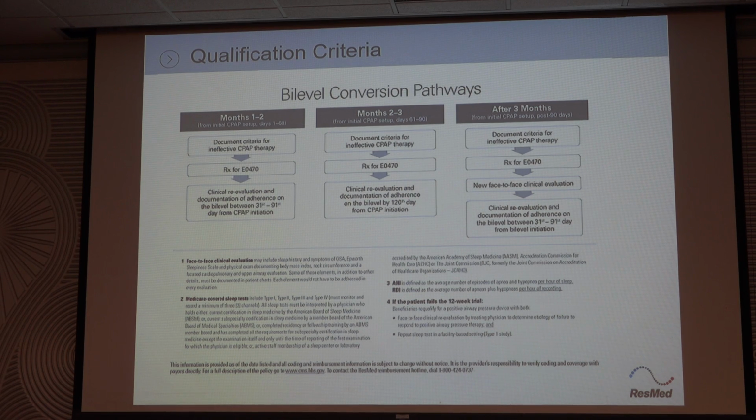So then a little light clicked on our brains to say, hey, we need to tell them we can see if they're using it now. And now, granted, we just log on the internet, on the website, and actually see if they're using it. We can change settings that way. That's what's changed hugely in the sense of you'll know if this patient's using it, you'll know if it's adequate therapy, and then you can actually address it.